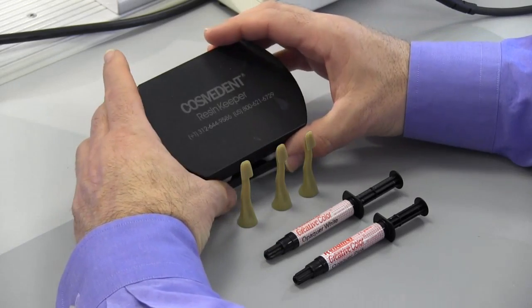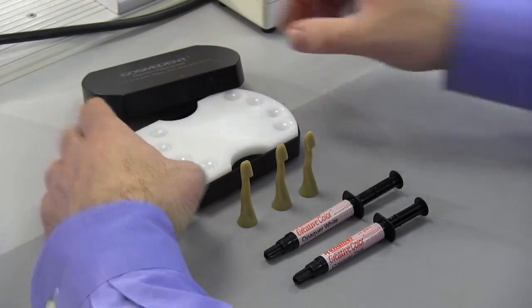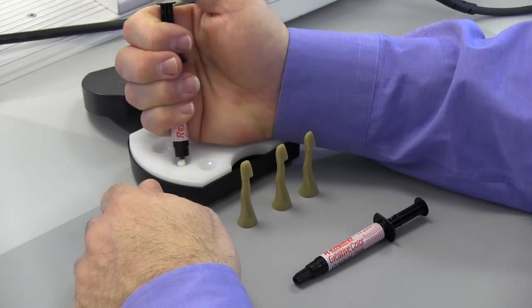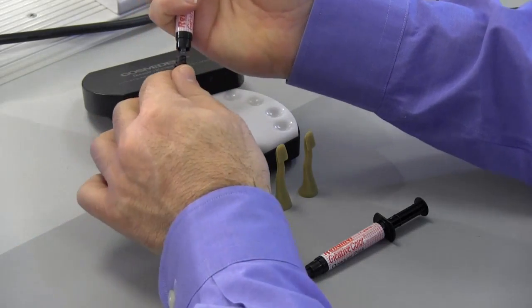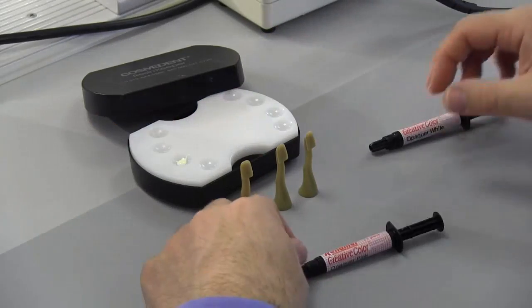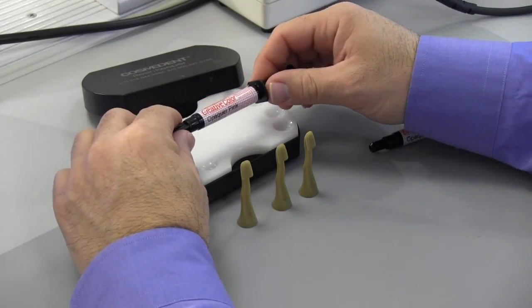We're going to first start by putting our material on our Resin Keeper, which is a nice, light sealed box that keeps the material from setting as you work. You can see we're placing the white opaque first, and then we're going to place the pink opaque right next to it.